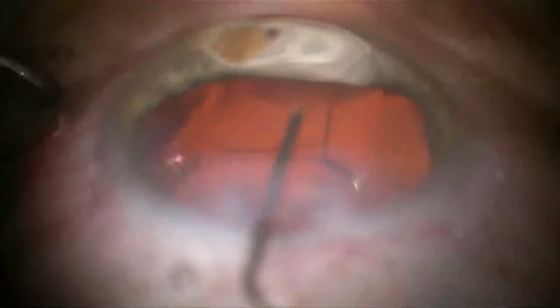I'm going to turn to about 2 clock hours away, but now I'm seeing the chamber flattening a little bit there, and I see some more folds in the cornea. So don't worry, just come out, take an extra step, fill the anterior chamber with some more cohesive viscoelastic here, and put some more on the cornea. By doing that, you're going to give yourself a little better view.